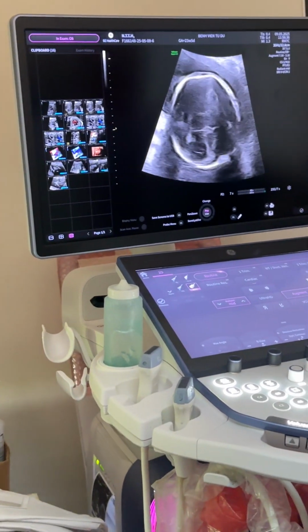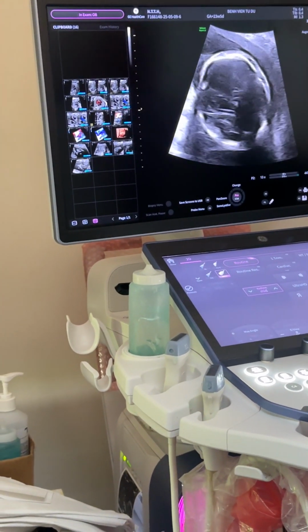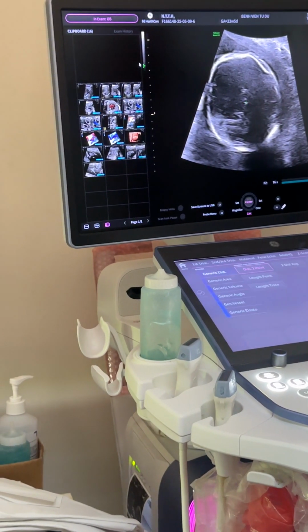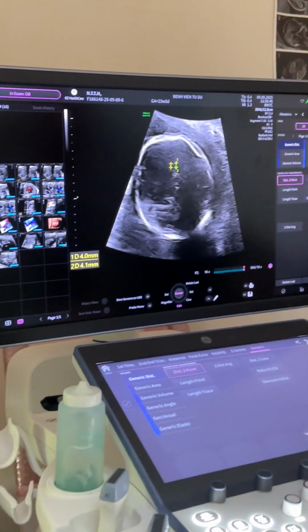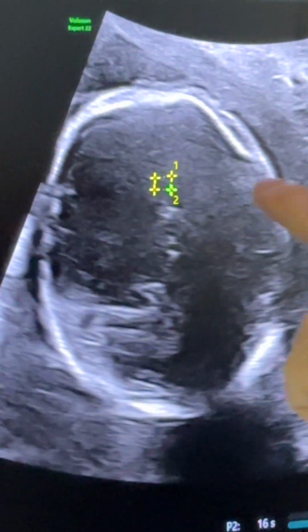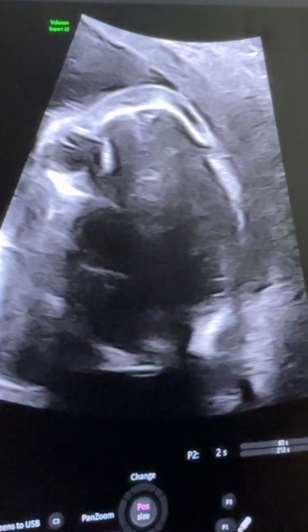So, when you are looking through the anterior fontanelle, this is not good imaging, but you just want to see the 2 lines of the genou. So you just want to see coming across here 2 echogenic lines, 1 echogenic line here and 1 echogenic line here. You want to see the genou, and when I see the genou, I keep the genou in view, and then I use my other hand and I rotate the probe. But the imaging is not good. The baby's not in a good position.